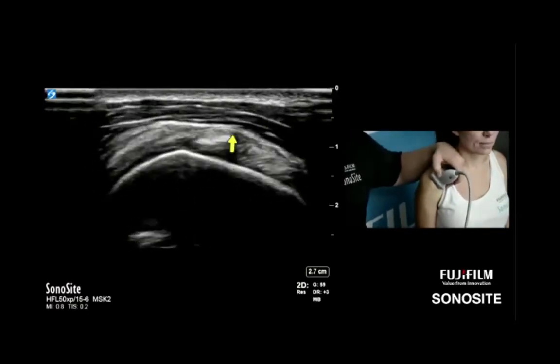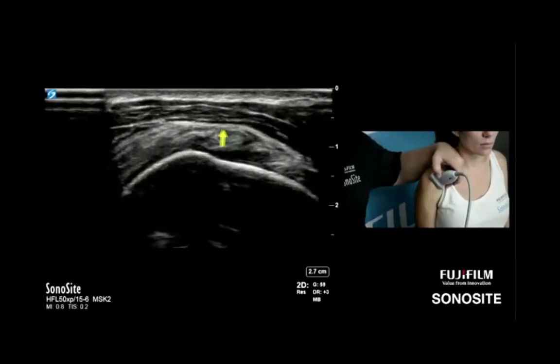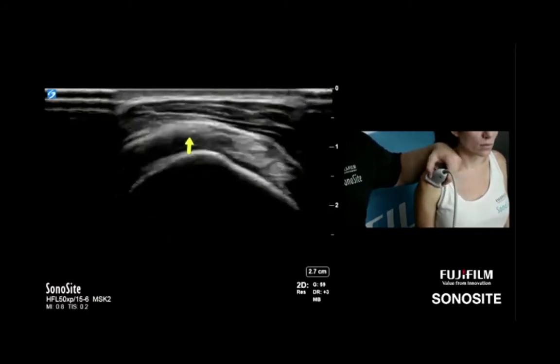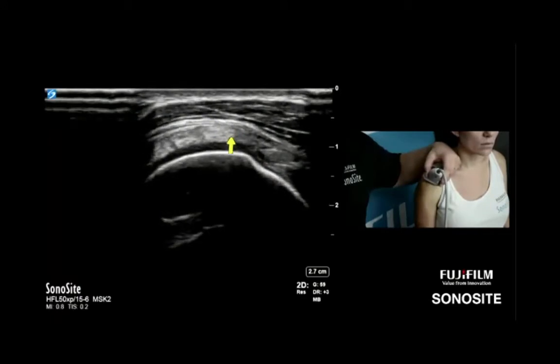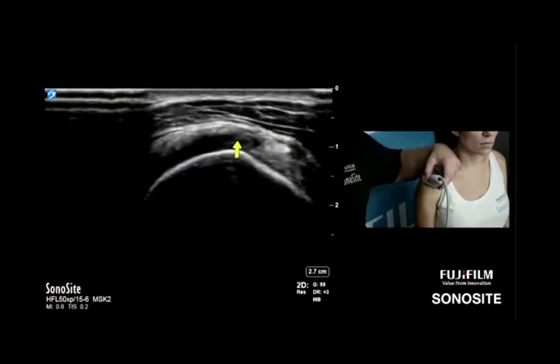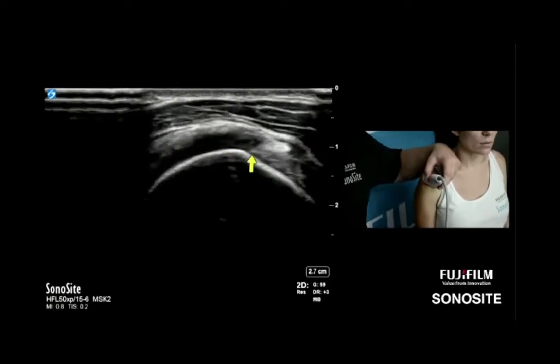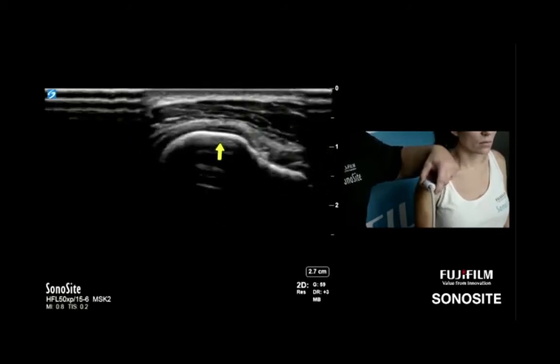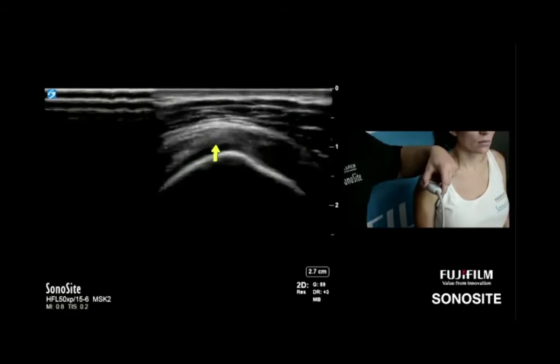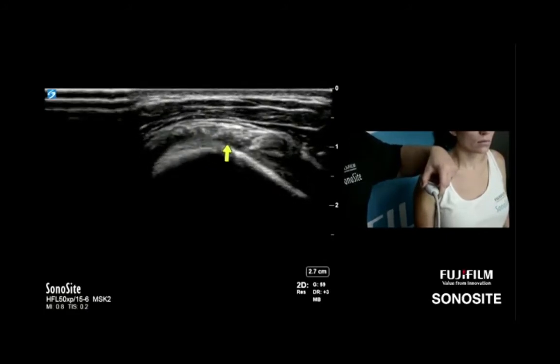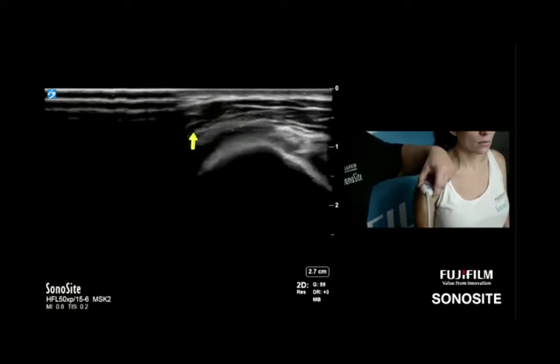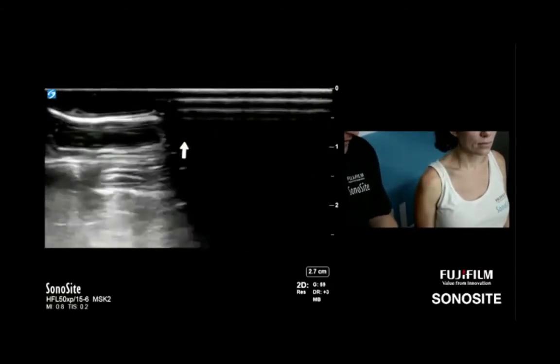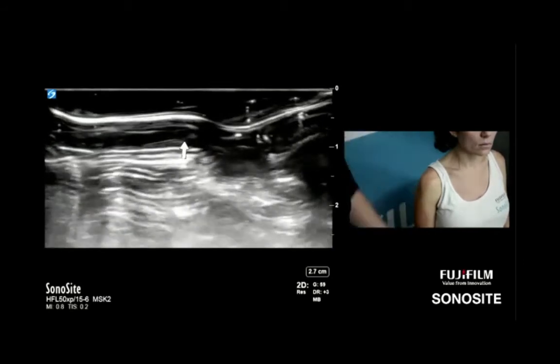The supraspinatus hasn't really started until this edge here, because the coracohumeral ligament is interdigitating underneath. The image quality on this Sonosite machine is very nice — I can see this ligament all the way up and over the biceps, all the way underneath the supraspinatus. Now following and centering until I have the supraspinatus in shot, going slightly distal, let's watch this bony contour and ignore the anisotropic artifacts until I find that Matterhorn shape Bill mentioned. I should see the greater tuberosity change shape.